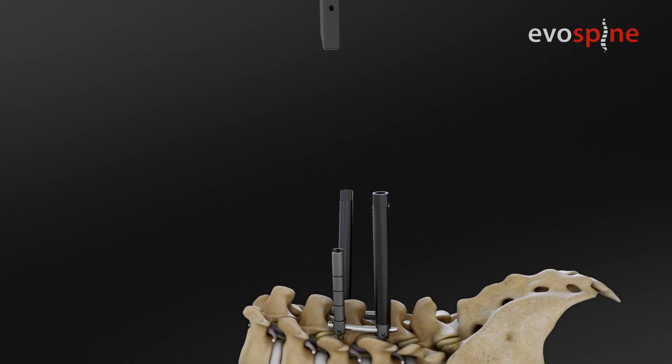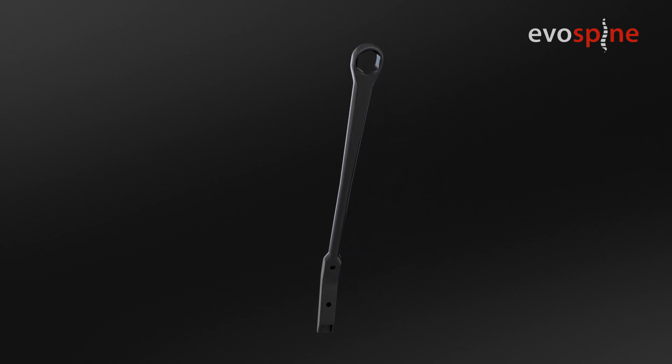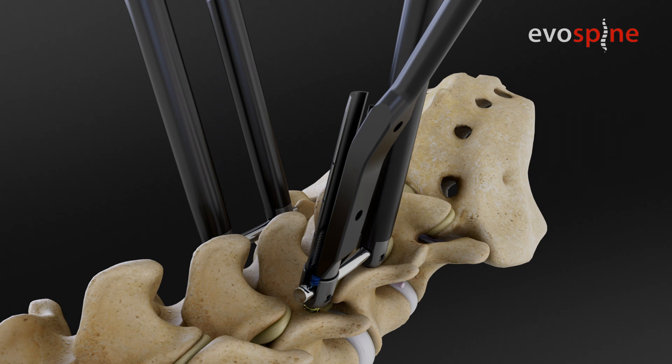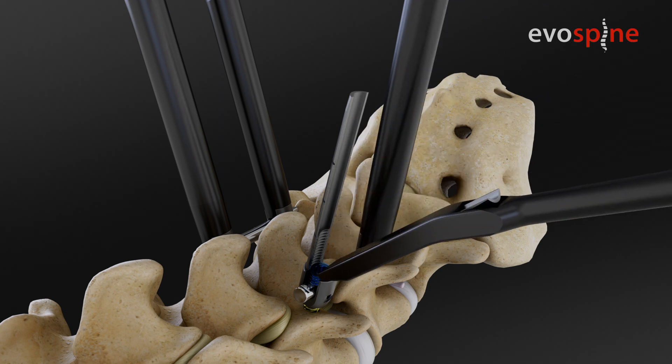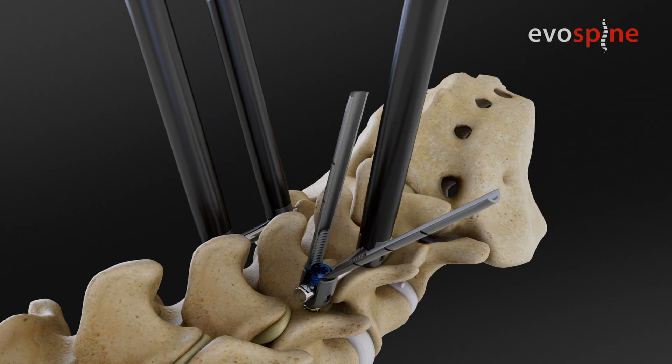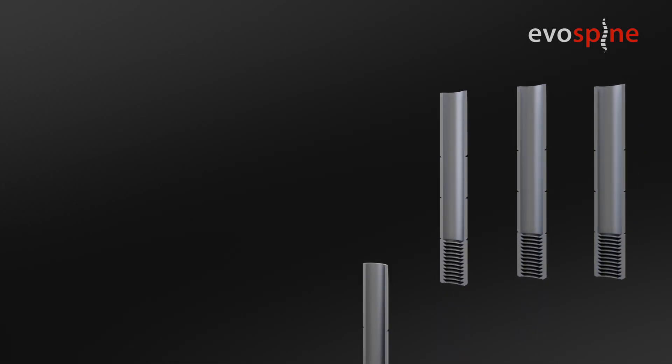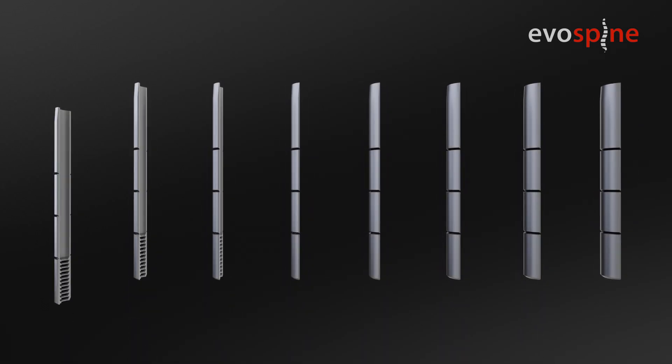Breaking the tab. Use the tab breaker, also with counter torque. Guide it over one of the screw tabs with the flattened side to the skin edge. Make sure you pushed it completely down to the nut. Break the tab by a quick move lateral to medial. Collect the broken tabs and make sure you have all four parts of each tab outside the patient.